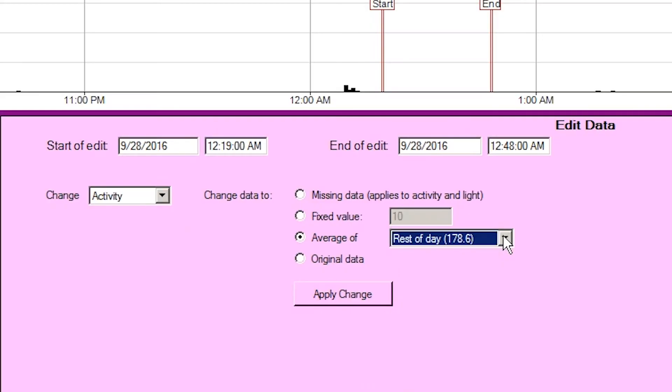If the last part of the recording is marked as missing data, then this will also reduce the length of the printed actogram to avoid printing unnecessary missing days. This is particularly useful if the motion watch continued recording while not worn at the end of a recording. In this case, simply select all of the time after the valid recording and mark it as missing data. This can be restored at any point using the original data option.